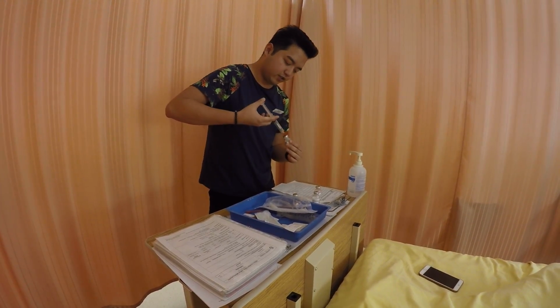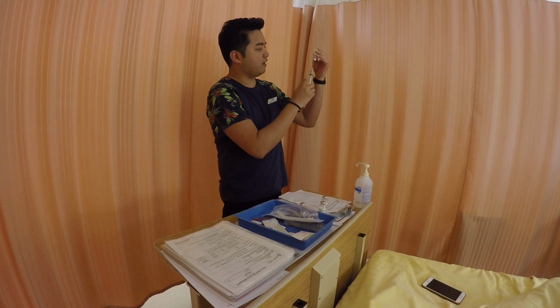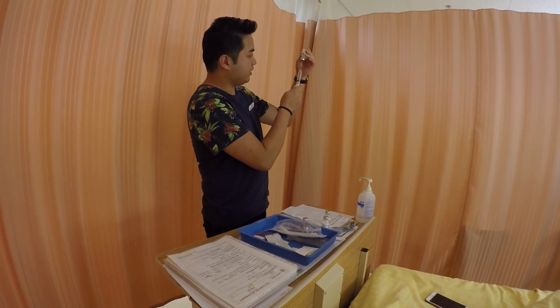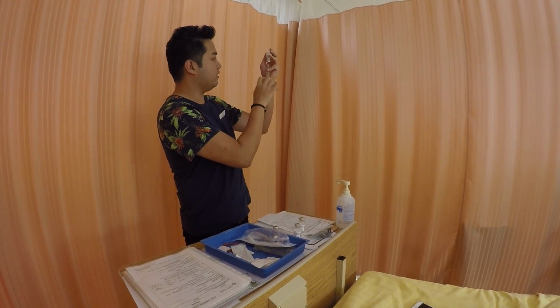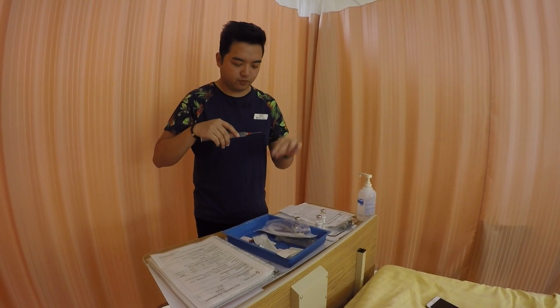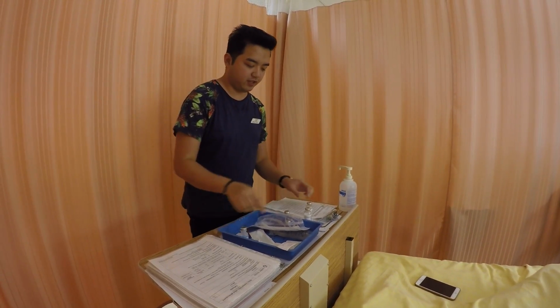We inject and push the 10 ml of air, and then get the 10 ml of sterile water. Make sure there are no bubbles so that we have the right amount. Make sure to cap it again so that it maintains the sterility.